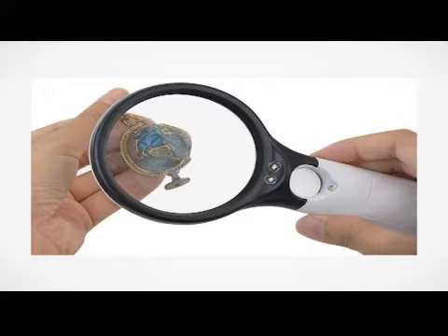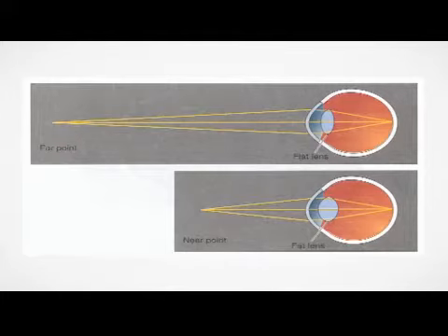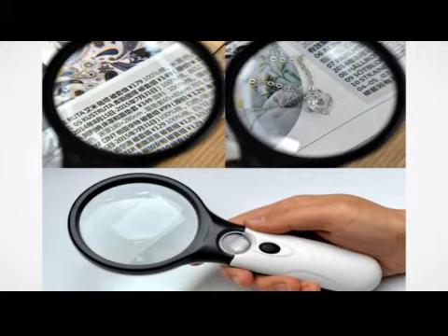Disadvantages: they must be held with one hand or sometimes with both hands. They are uncomfortable and could cause hand and arm fatigue with extended use. The reduced field of view also slows down reading. They must be held at the correct focal distance for maximum power. They can be difficult to use for children with limited dexterity or hand tremors. They provide a limited field of view in comparison to spectacles. They are somewhat less effective than spectacle frames with the same power.